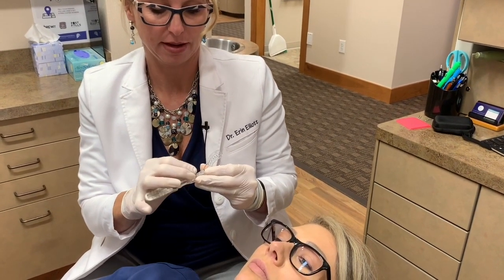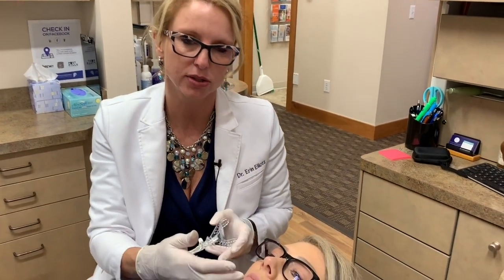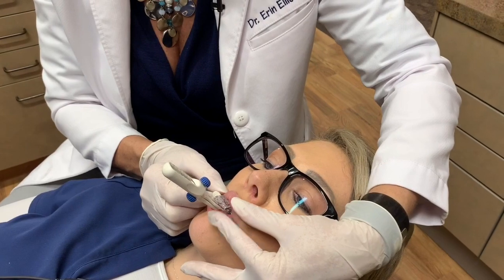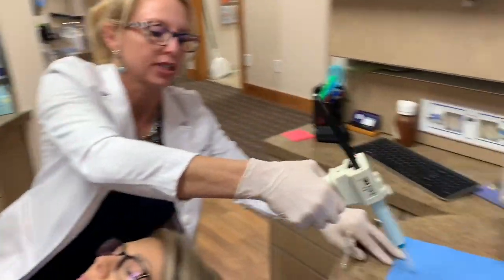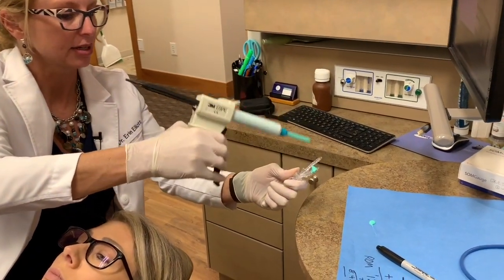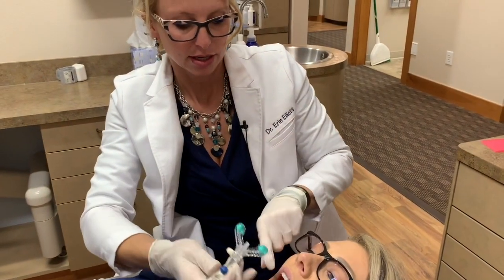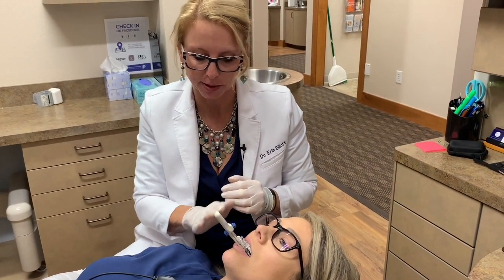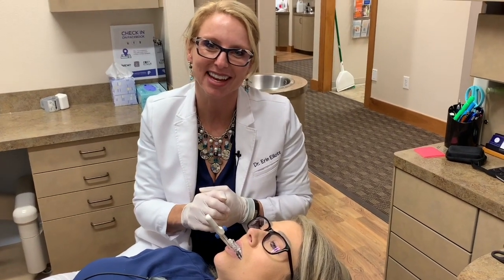I like to keep the vertical at a minimum for lip seal and comfort. The only time I really add vertical is if the patient still has a little snoring and if I get improvement. So let's go ahead and put that in — bite down, relax the lips. When we do the bite registration, depending on if you're scanning or sending this in — we scan — so I do just a few dollops. The reason is mostly to stabilize the jaw, because if the patient has to do all the work to hold it in place, they get muscle fatigue and movement. We do that in the back so we can still get the buccal bite with the scanner. If I was sending it to the lab, I would get cusps tips on all the posterior teeth. That's how we use the SOMGAGE — and now we're going to practice on each other.